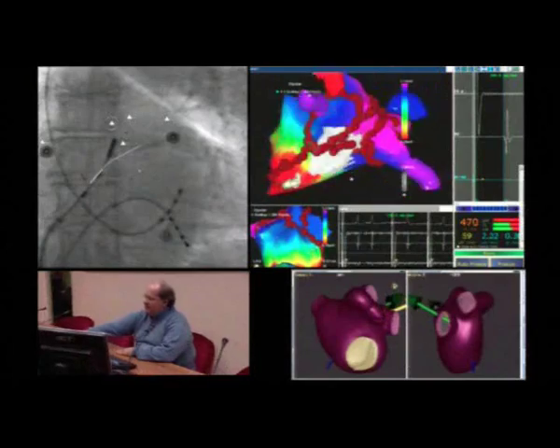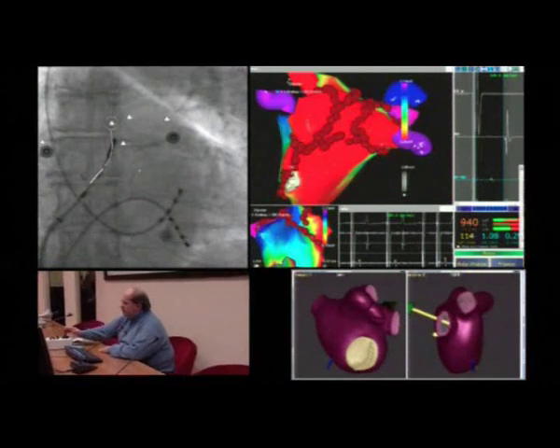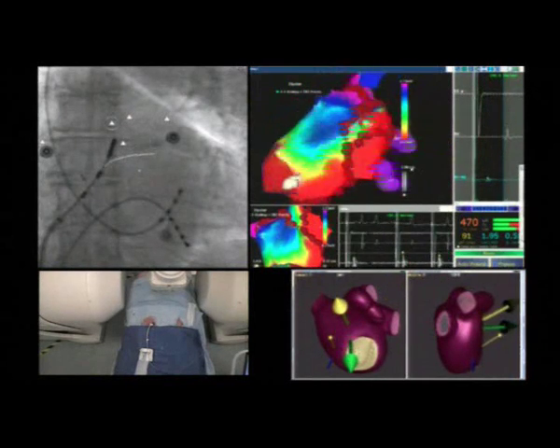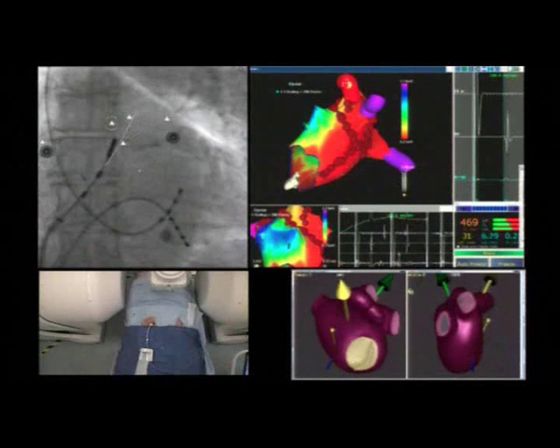On the CARTO screen you can see the color-coded scale: red indicates the lowest voltage whereas violet indicates the highest voltage.